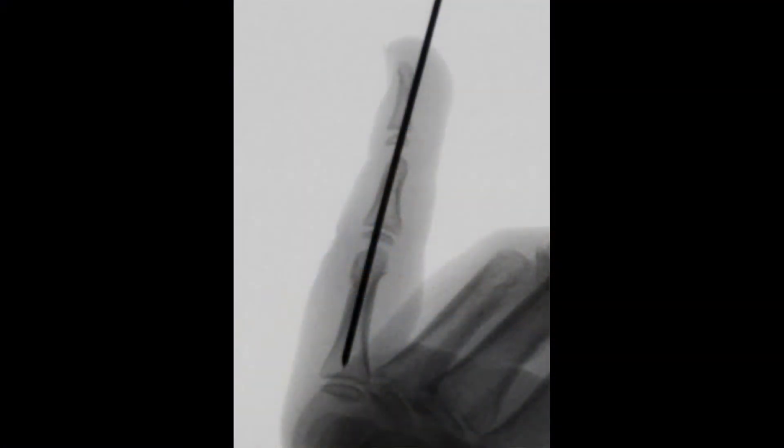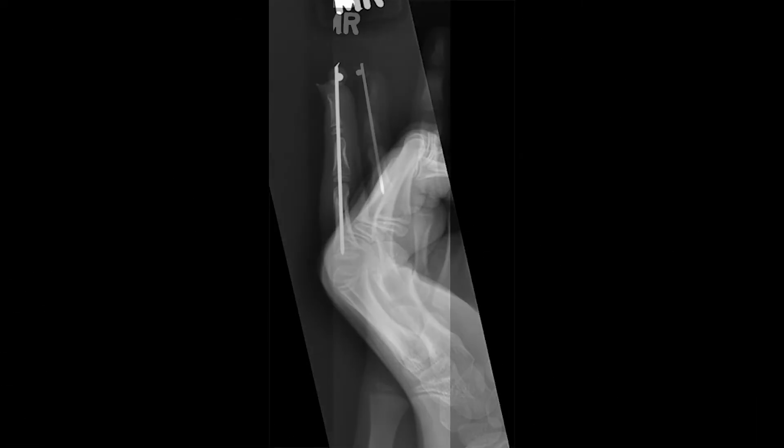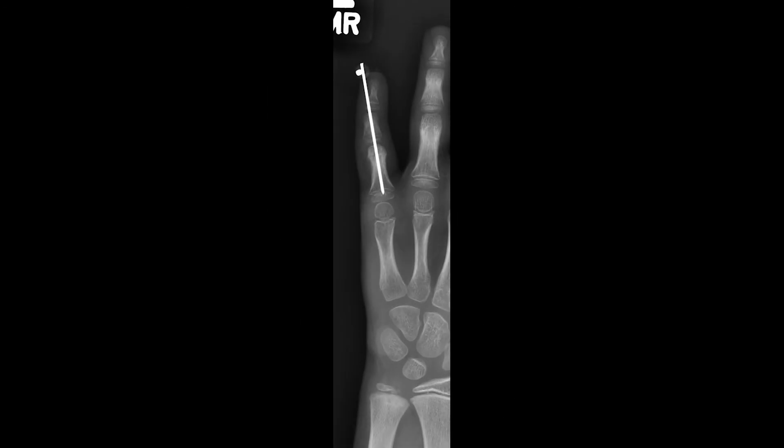Adequate fixation of the fracture is noted and the k-wire is in good position and is cut short. Postoperative X-rays at four weeks show interval healing with anatomic alignment. The k-wire is removed and range of motion is instituted.